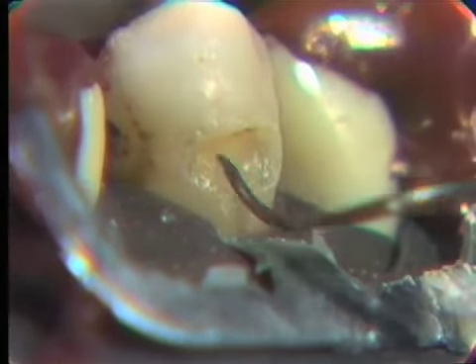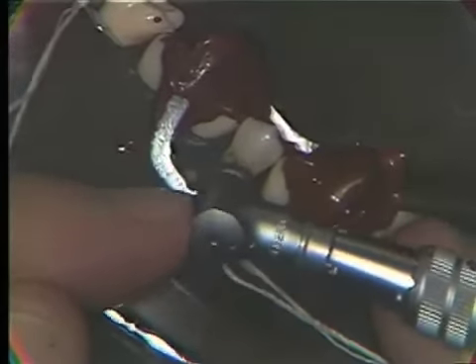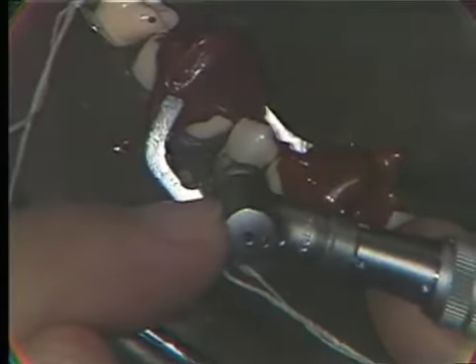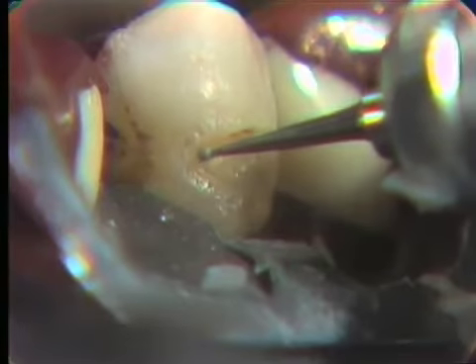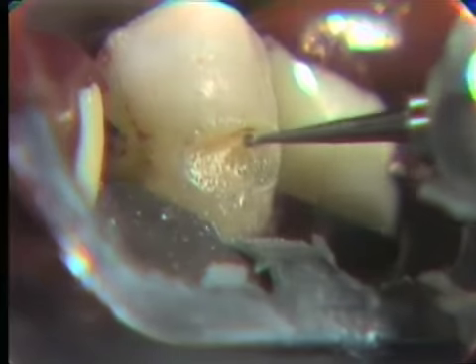Now what we want to do is establish retention up at our occlusal wall. Once again, feeling the axial wall, resting the burr on the occlusal wall, rotating the burr, and drawing it along that wall.